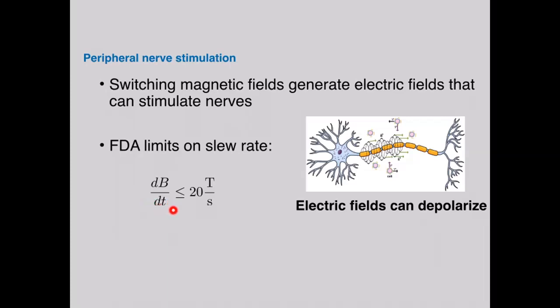You can actually stimulate, let's say, the heart, which could actually cause death. So you've got to really be careful there. I've had my back muscle stimulated using some sequence, and sometimes people see flashes in their eyes when they do it, in particular for EPI sequences like fMRI. fMRI is a very typical sequence where you get a lot of stimulation, and also diffusion.